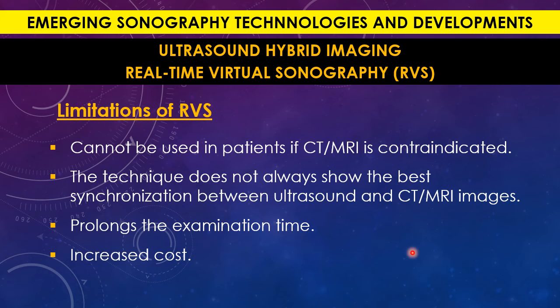Second thing, it doesn't always correlate, because sometimes the correlation between the CT or MRI pictures and the ultrasound is not that accurate between the two images on the display. So, correlation problem. Third thing, it prolongs the exam because it takes longer to correlate the images and to upload the data and all of this. And it increases the cost to the patient.